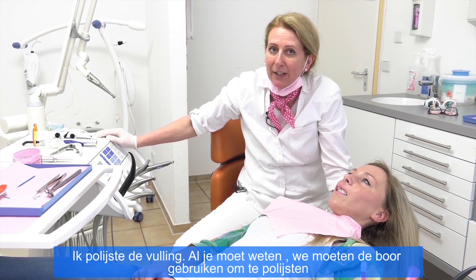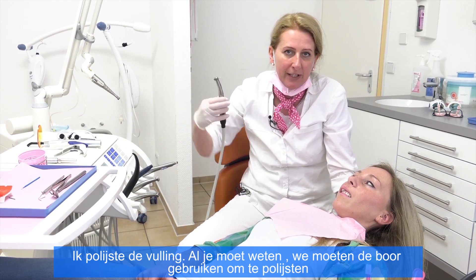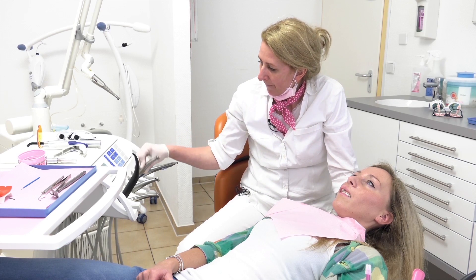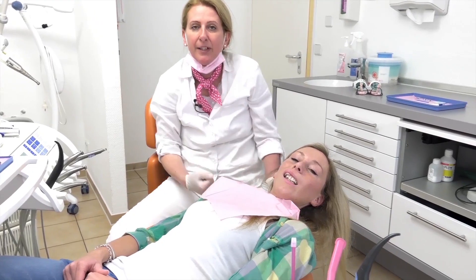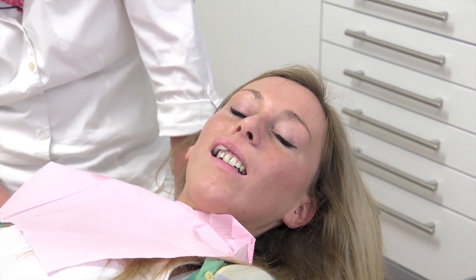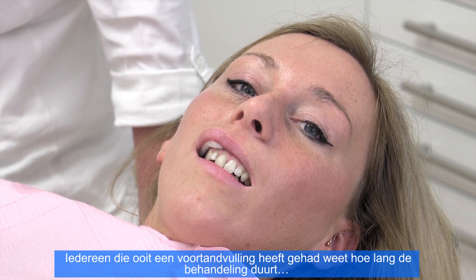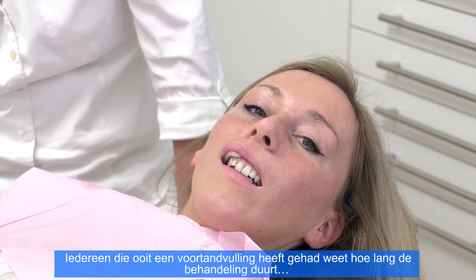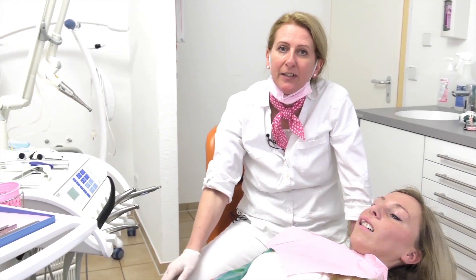We are ready with polishing the filling. You must know we can't use the laser for polishing — we do need the ordinary dentistry drill. Just have a look at this fantastic result. The polishing needed about 10 to 15 seconds. Everybody who has already had a filling in the incisor knows that polishing usually takes a long time. Here you can see the fantastic results.